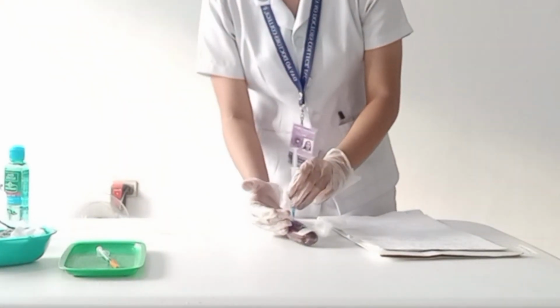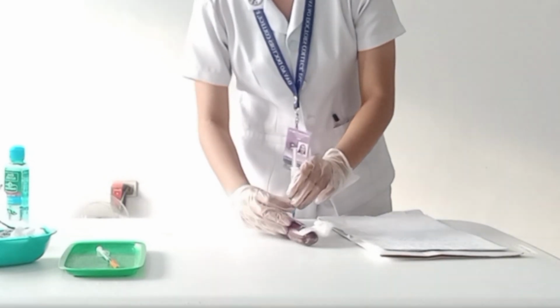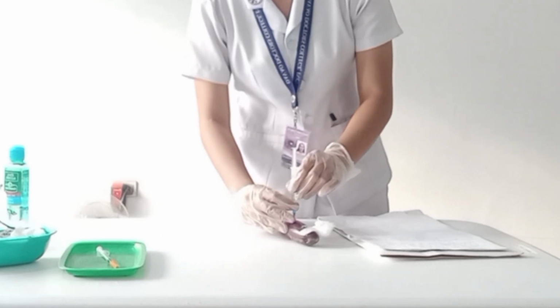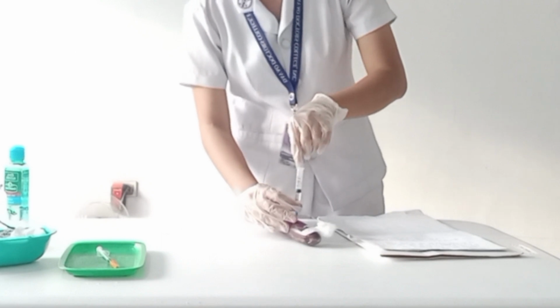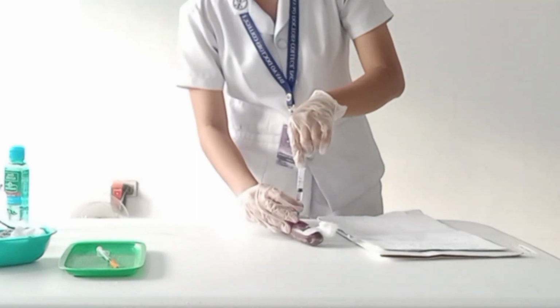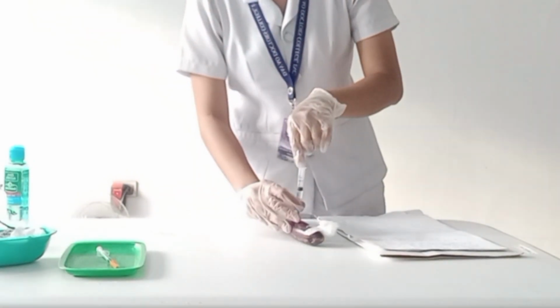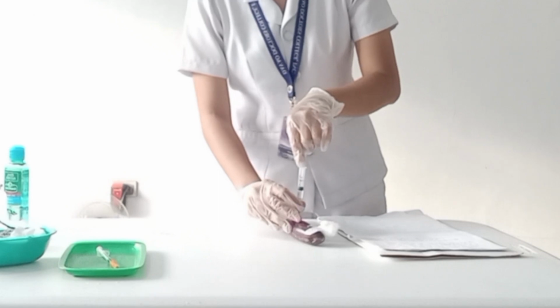So now I have to hold the barrel of the syringe steadily with my non-dominant hand and aspirate by pulling back the plunger with my dominant hand. So I have to aspirate for 5 to 10 seconds. So if blood appears in the syringe, withdraw the needle and discard the syringe and prepare a new injection.